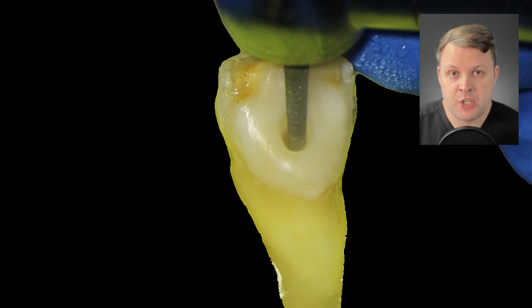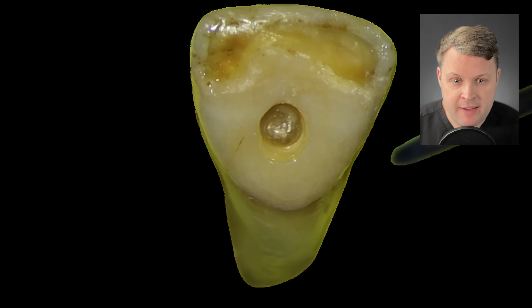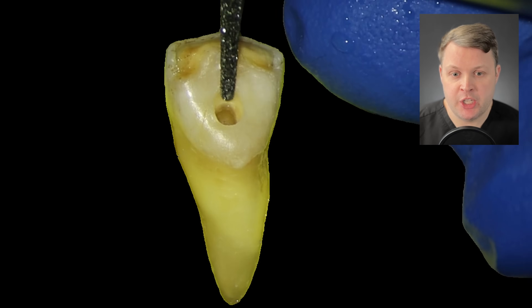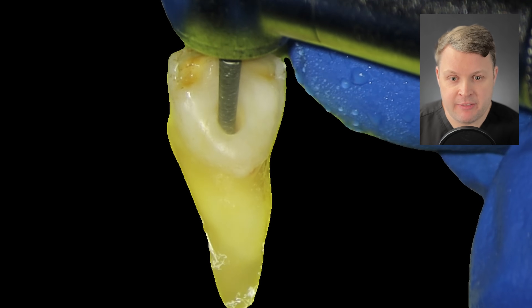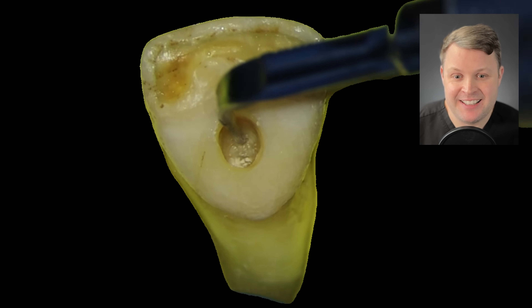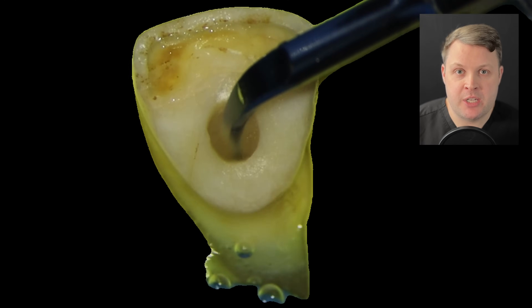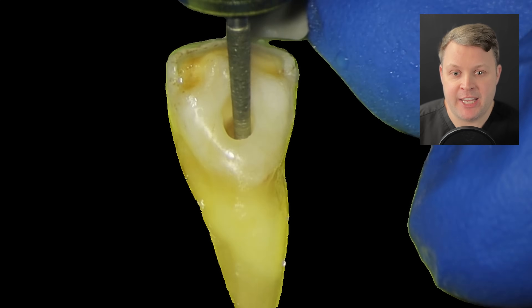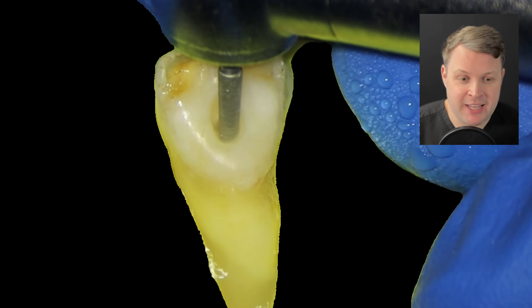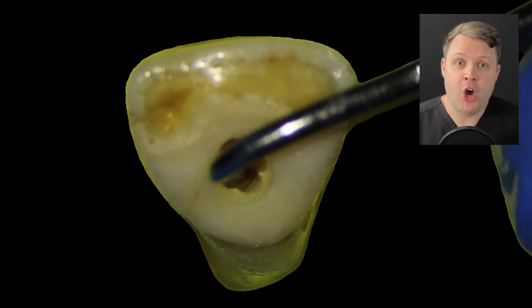The pulp chamber isn't exposed yet, so we cut a bit more with the fast handpiece and probe again — still no breach. We do it in steps, not going gung-ho. As I drill into the tooth we get that drop feeling, and we know now we're into the canal space and I've breached the pulp. I'm going to use a high-energy ultrasonic just to make sure I'm opening up this breach in the access cavity, and then do a little fine tuning with the fast handpiece — being super careful not to over-prep the inside of the tooth. It's not pretty, but we're in.